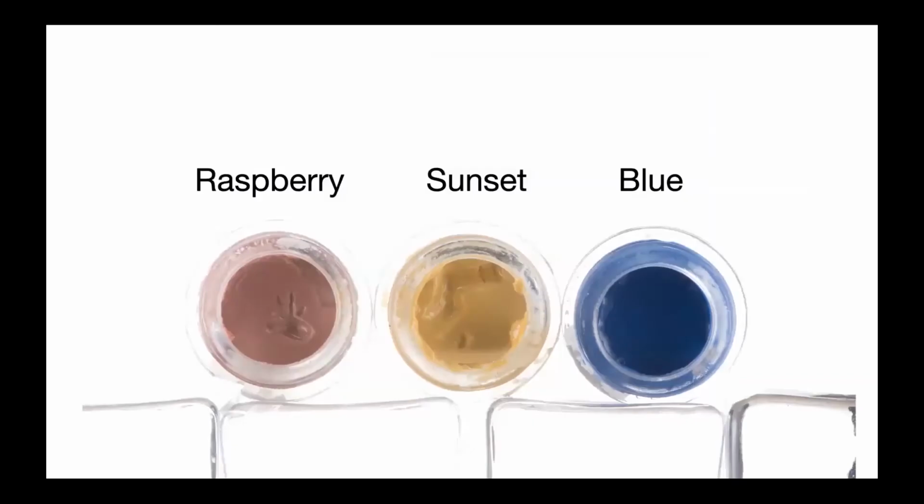And this shade is the ideal solution when we have a plan to create the illusion of translucency, the illusion of transparency of our monolithic restoration. When this mixture is applied on the surface of the monolithic restoration, we can change the light, we can increase the absorbing of the light, and visually this segment will look more translucent, or even more transparent.